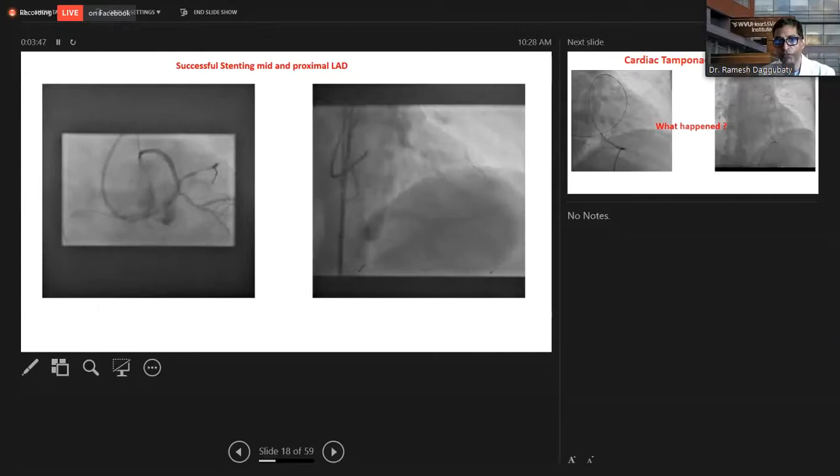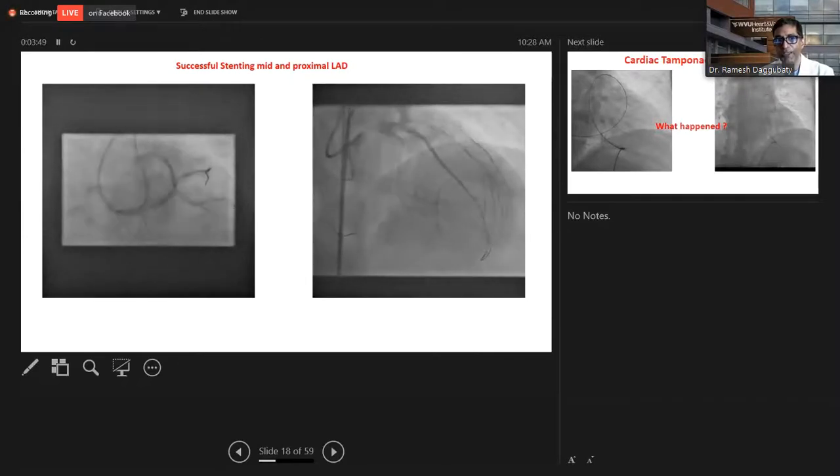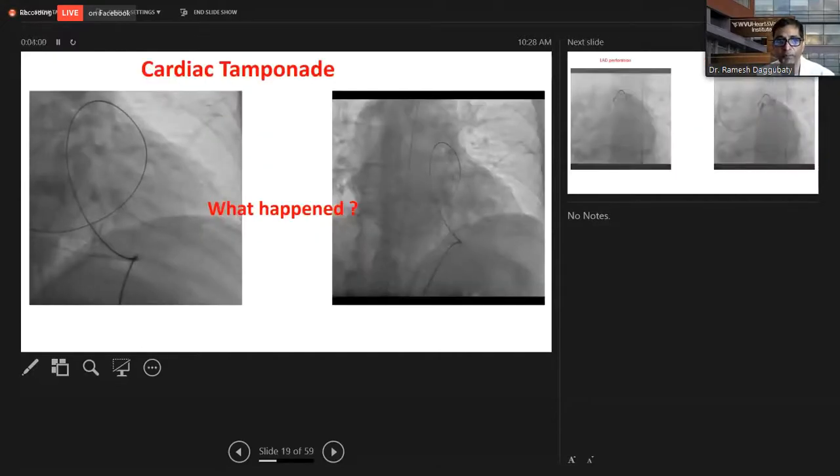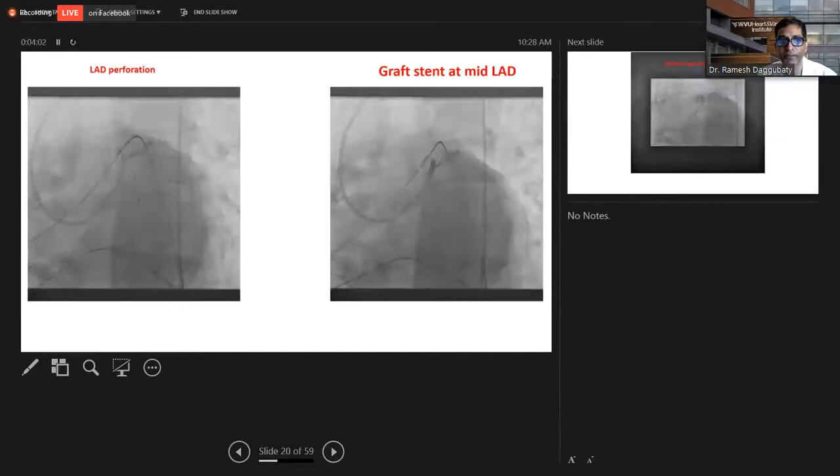So I think what we should have done is immediately balloon tamponade it and then look at what actually is going on. I think sometimes we get caught up: oh, I opened up the CTO, very successful, and did not pay attention to that small blush, and that resulted in cardiac tamponade here too.